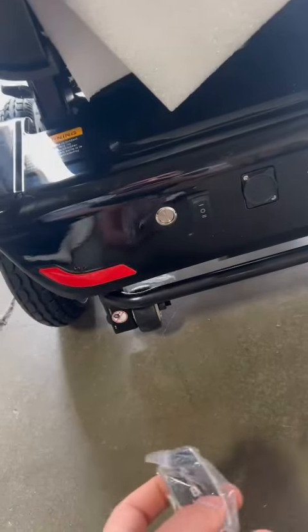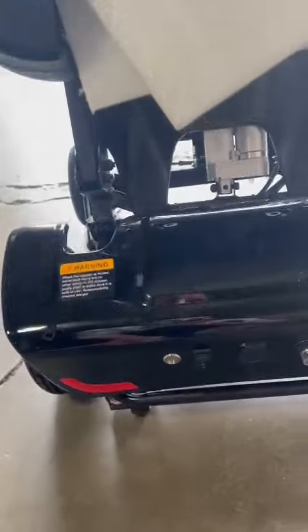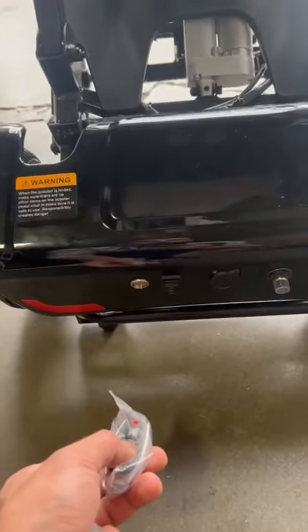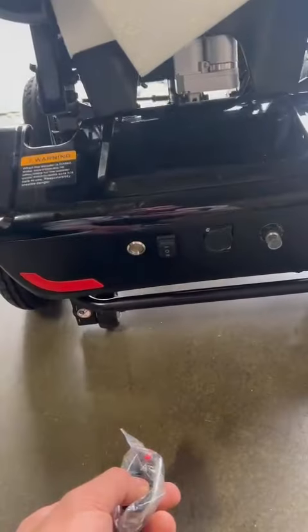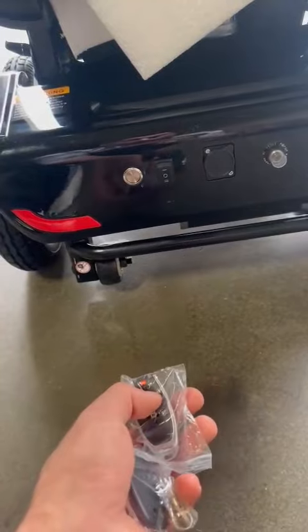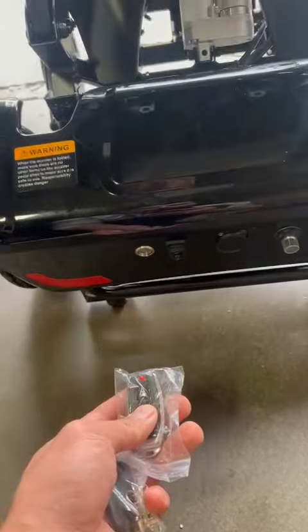Second, let's try with the remote. A — unfold. B — folding back. One more time, I try another remote. A unfolds. B — fold back.